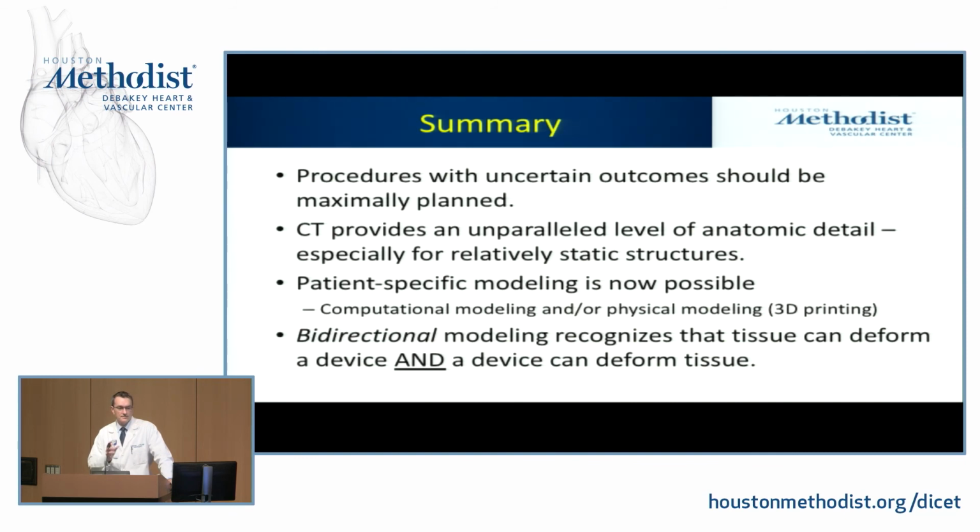And the notion here is that it gives you the idea to do bidirectional modeling, because if you have soft materials like are being developed, you can actually model the deformation of the material by the device and also how the material models the device. So they both change each other. And if you try to do this modeling into a rigid structure, you won't be able to capture that.